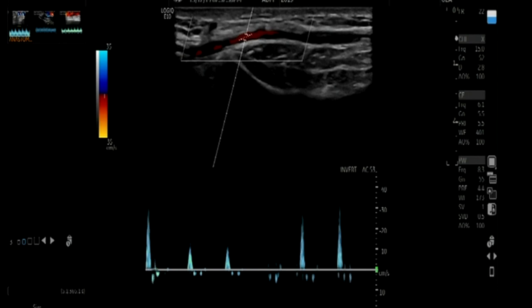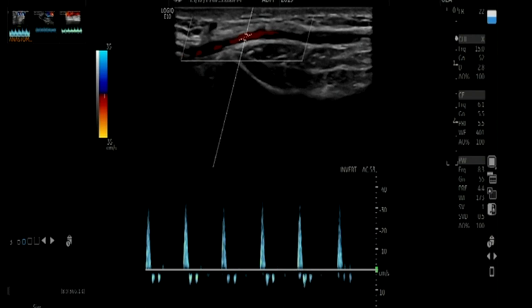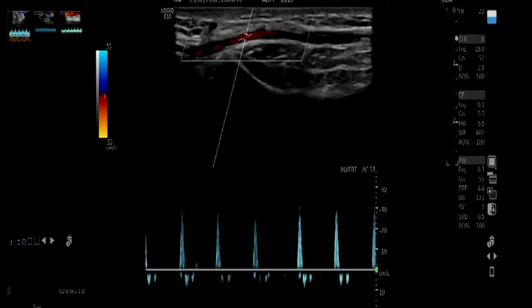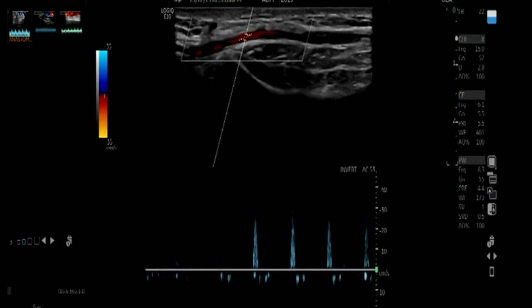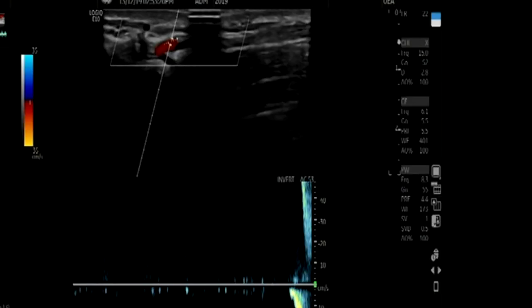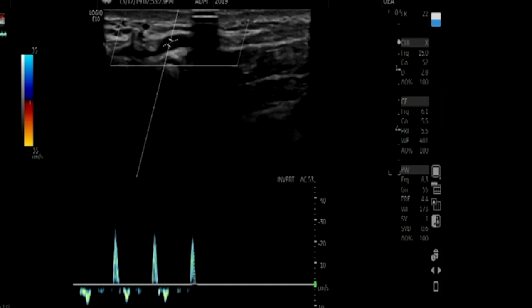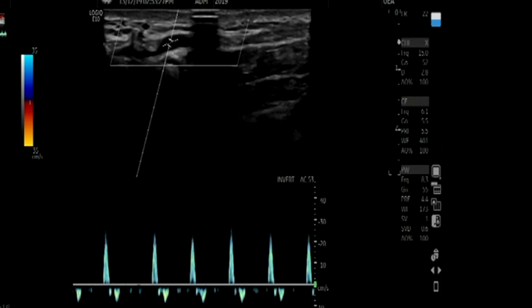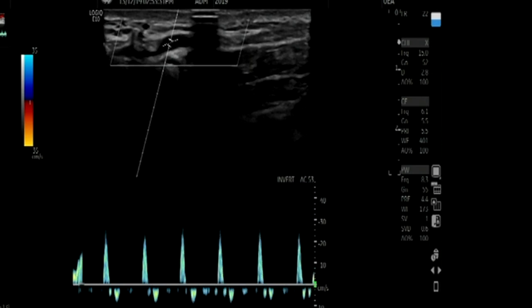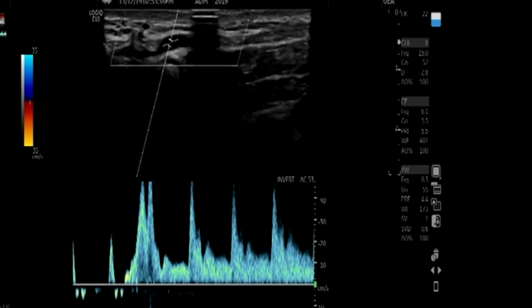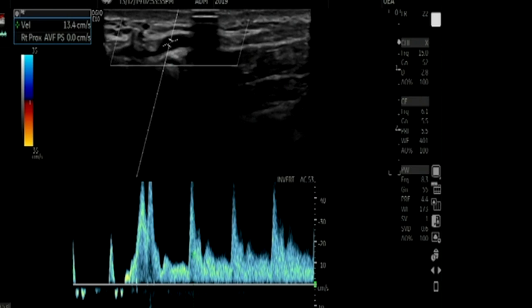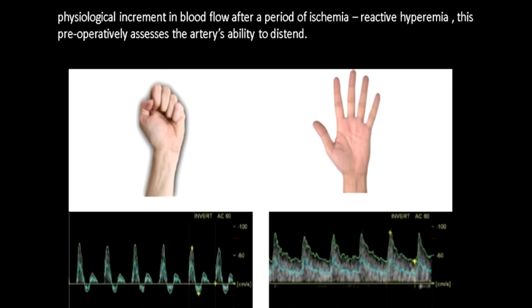Sample the radial artery and you see a triphasic flow pattern. For pre-AVF mapping you need to check the elasticity of the vessel using a fist-clenching maneuver. Ask the patient to clench his fist tightly — you then take a waveform showing very high resistance flow. After a few seconds, ask him to release. You can then see the changeover from the triphasic high-resistance pattern on the left to a high diastolic flow pattern on the right. This physiological increment in blood flow after a period of ischemia is called reactive hyperemia.